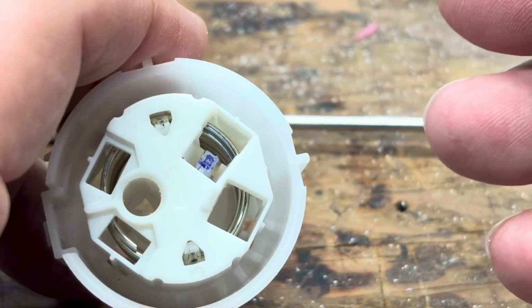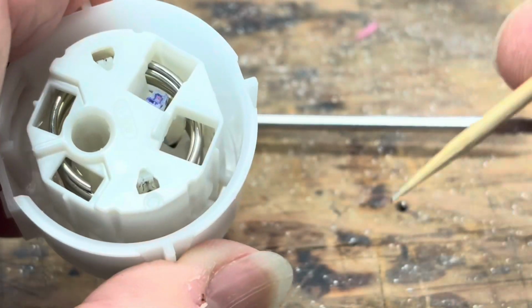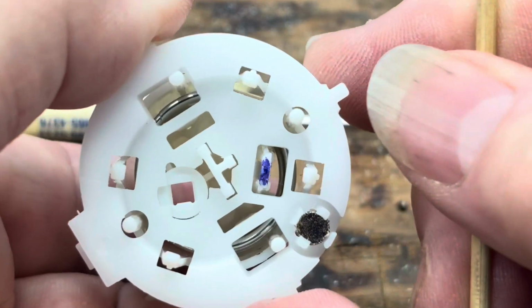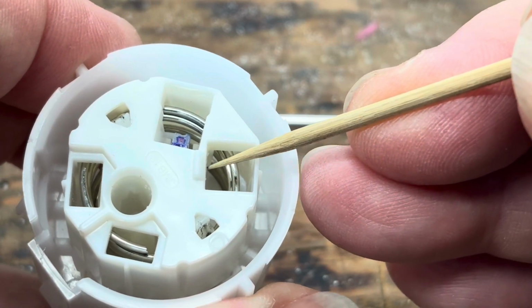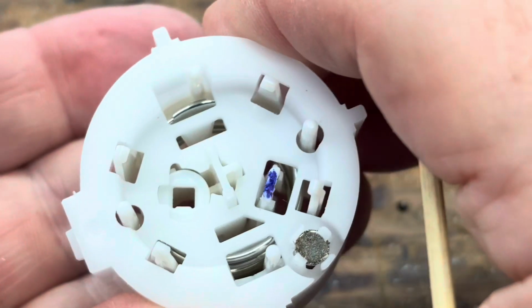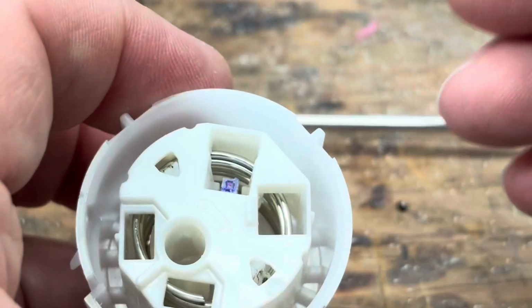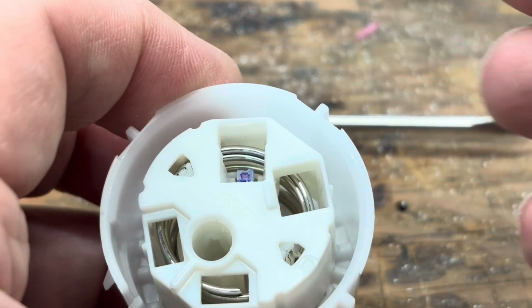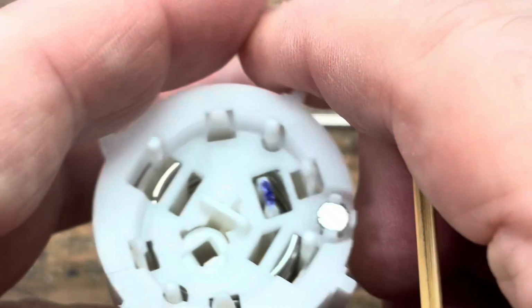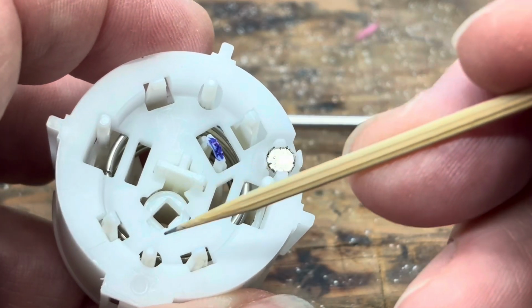What triggers it is that hook in cup 2 fits through this hole, and as this device travels towards the patient's arm, that hook suddenly hits this shelf, arrests the travel of cup 4. 3 continues to travel. Those pinch points are released. The spring can then extend beyond those shoulders and push cup 4 away from cup 3, which releases the fingers that are holding the device and retracts the needle.